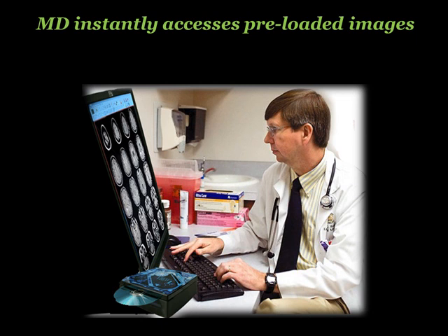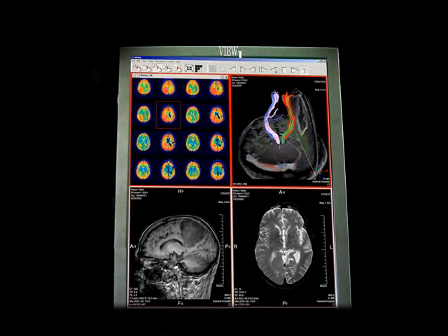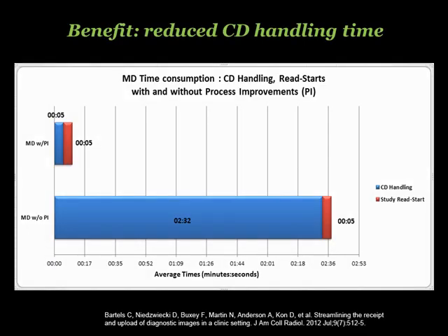I'm now looking at one user interface that has a list of my patients, and as I click from one patient to the next, I can see all the imaging studies listed for each one of the patients in clinic, and they're preloaded on the computer. I'm not waiting for the CD to spin, and I get a very much facilitated and accelerated image review session before I go in and see the patient.